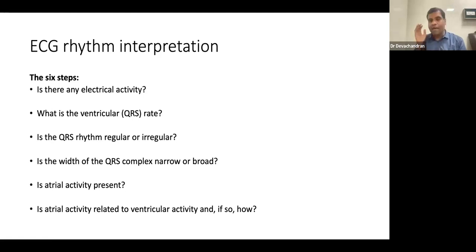So first we talked about the pacemaker cells, SA node, AV node, His bundle, and the Purkinje cells. Then we talked about the lead positioning, V1 to V6, and where you keep the AVR, AVL, and AVF. So generally, the way I remember, or across the world, it is taught is red for right, yellow for left, green for spleen. So that's how it is taught across the world, so that you can remember to place the leads correctly when you record ECGs.